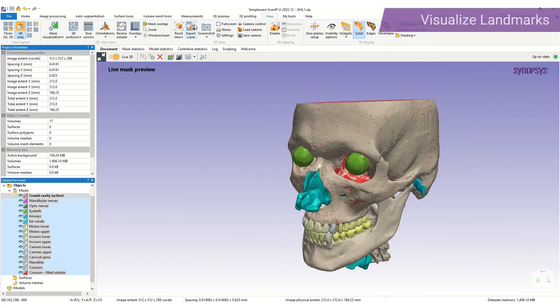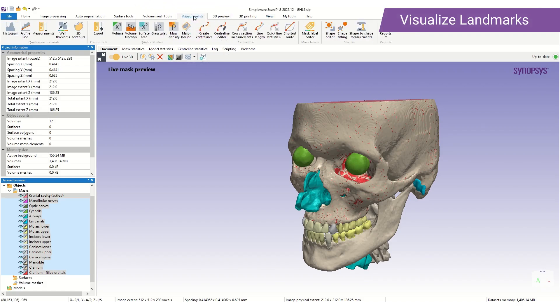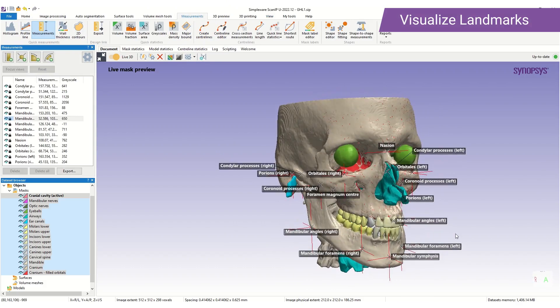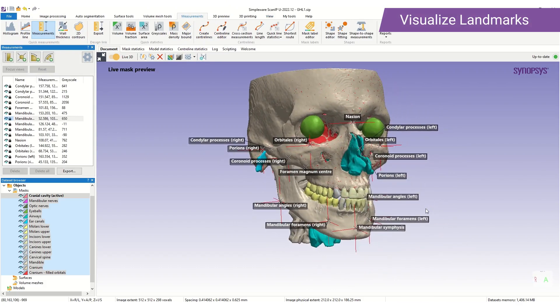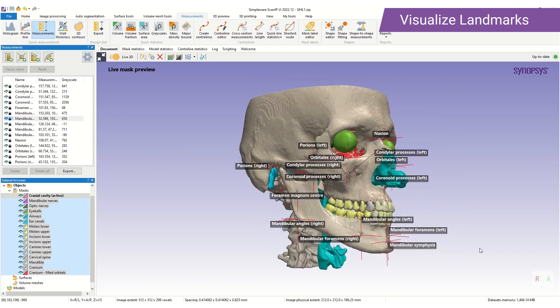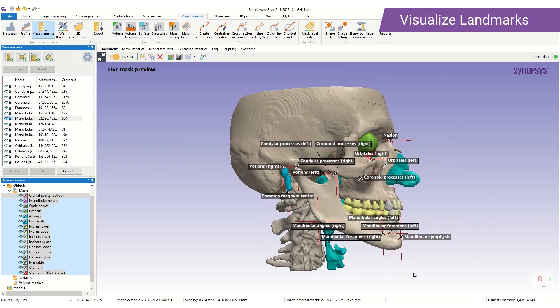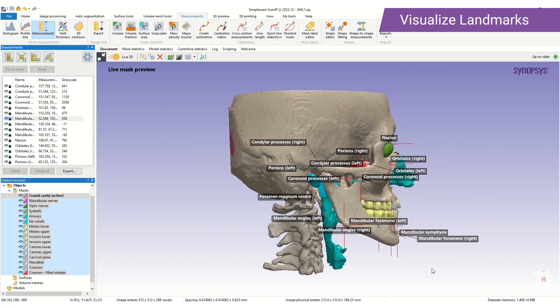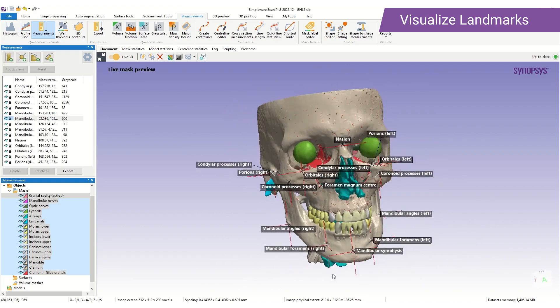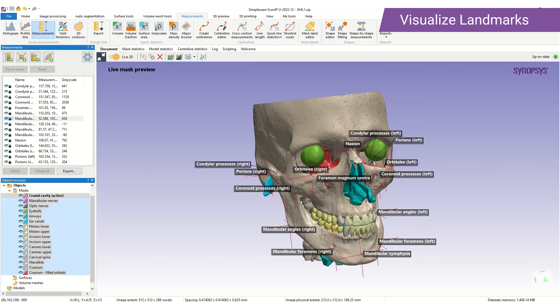To visualise the landmarks we have produced, we navigate to the measurements tab. Here you can see all the landmarks generated in the auto segmentation process. These include the mandibular foramen, the mandibular angle, mandibular symphysis, the coronoid process and the condylar process. In addition we have the orbitale of the cranium, the porion, the nasion and the foramen magnum centre.